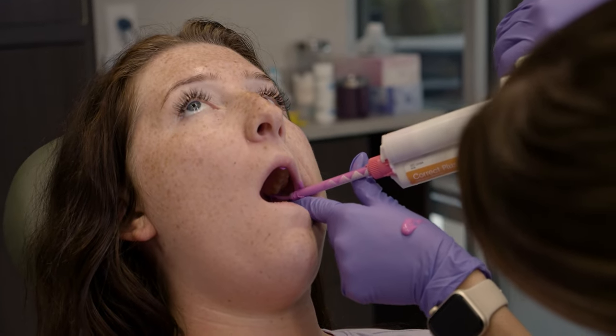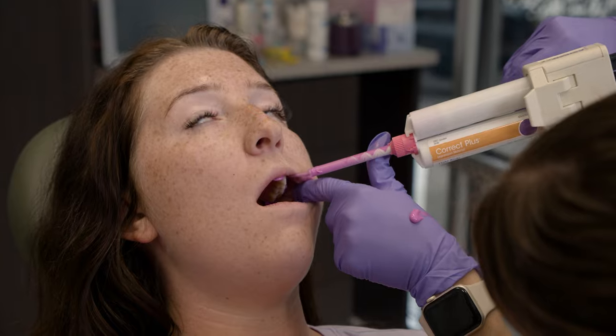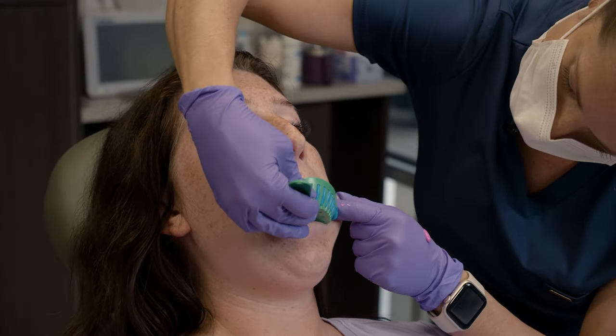Once you've fully loaded your tray, you'll want to quickly attach the curved applicator tip and apply some light body material to the very distals of the terminal molars, and also apply a light wash across the gingival margins of the buccal aspect before taking your loaded impression and seating it into the patient's mouth.